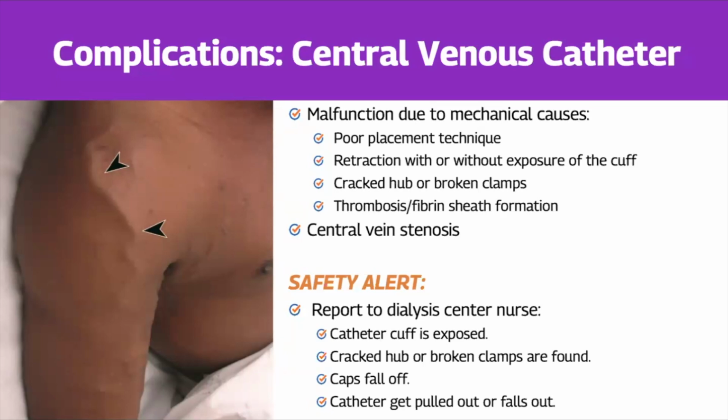We don't see that as much anymore. Back when I was a new hemodialysis nurse about 30 years ago, we had a lot of subclavian catheters. They could be tunneled, they might not be tunneled, but they would cause this venous stenosis. And we would have huge edematous shoulders and arms. The patients were in pain, very uncomfortable, and had to be surgically repaired, and sometimes could not be repaired.